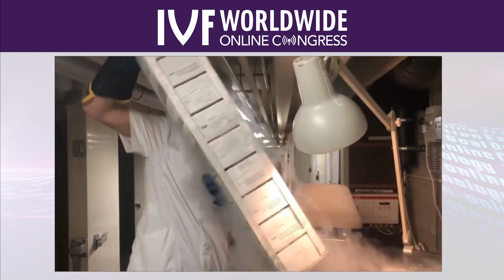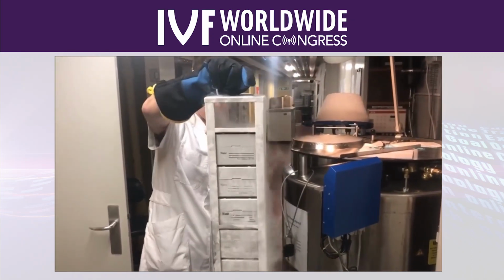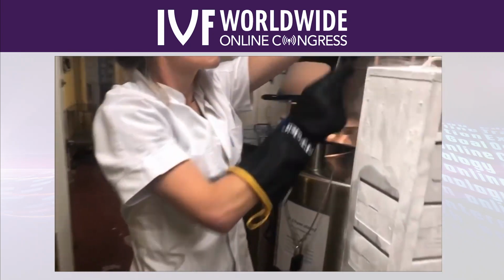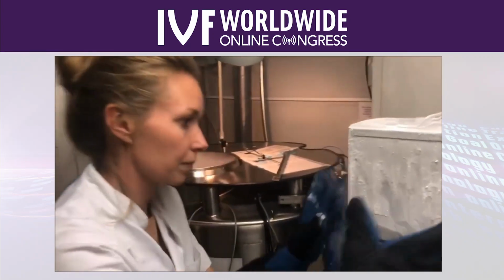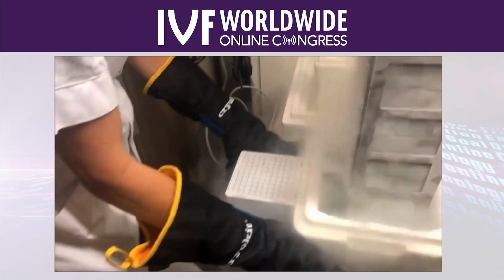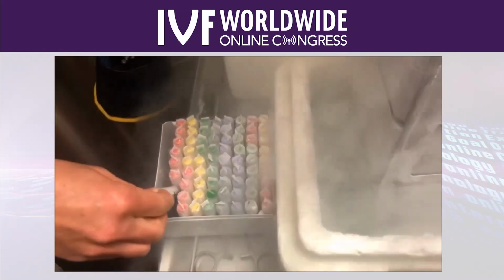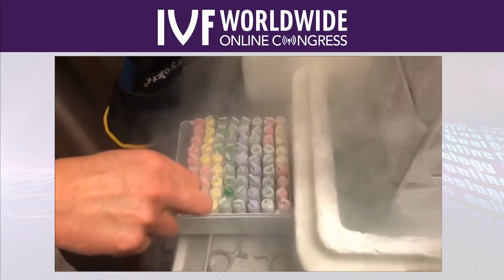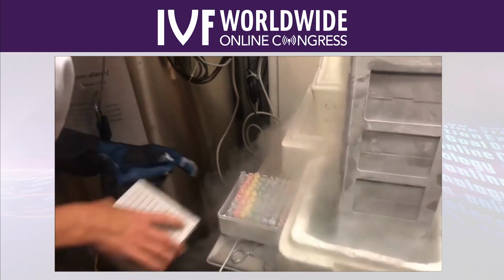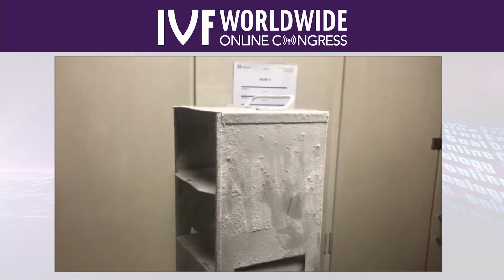So we have 5 big cryotanks in our lab, and we always ensure that we split the samples into 2 tanks, just in case that any of the tanks, God forbid, should run out of liquid nitrogen or something will happen, then we still have half of the tissue in one of our other tanks, which is located in a different room. So we have 10 tubes in each tank, and here you can see the tubes going into the rack with the color coding, which makes it easier to locate the tubes when we need to find them again.